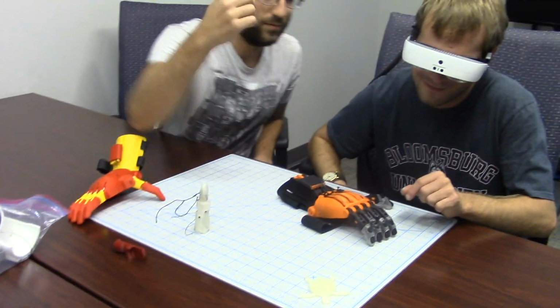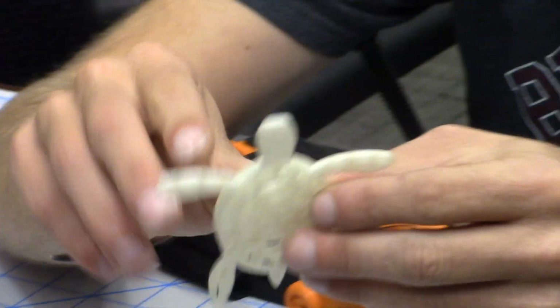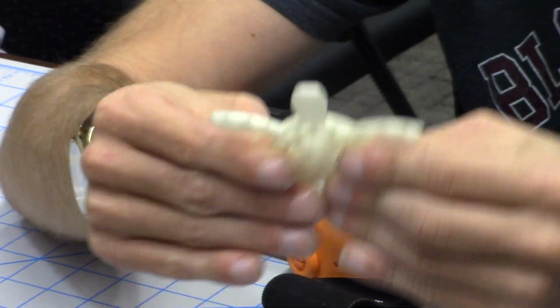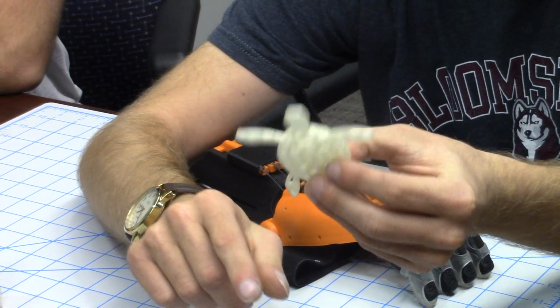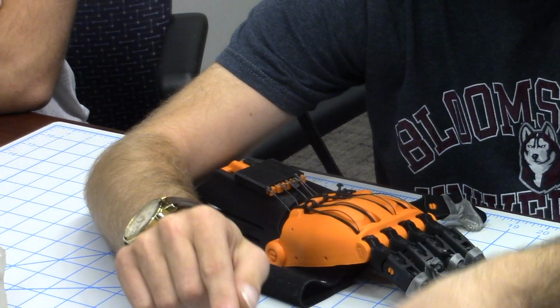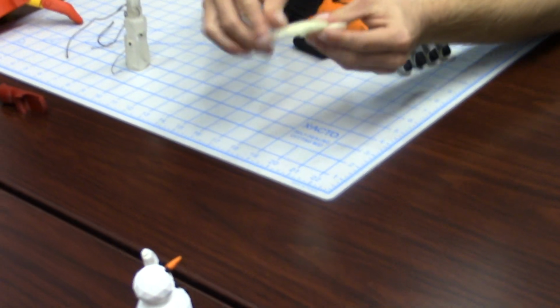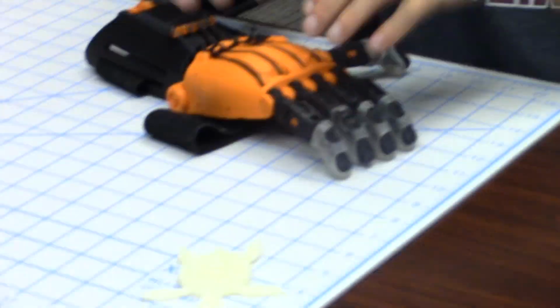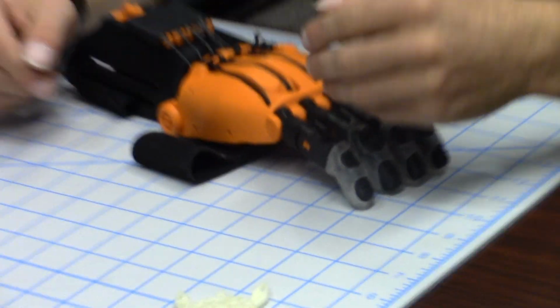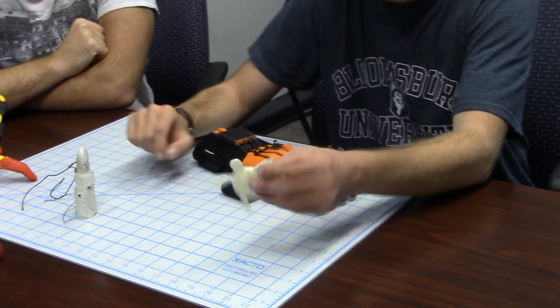And then we have Jesse, if you want to pull that out. This little guy is made out of a flexi material that you can actually squish, and we use the turtle to practice on. What we're trying to do is use this material for an actual hand. They'll be able to flex it like that. It's just easier to do than this, you don't have to assemble it. It's just all the material. But it's still a work in progress.